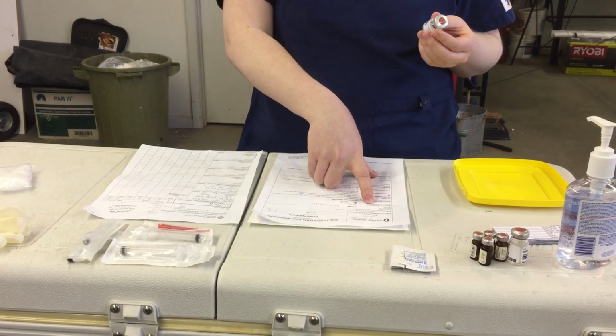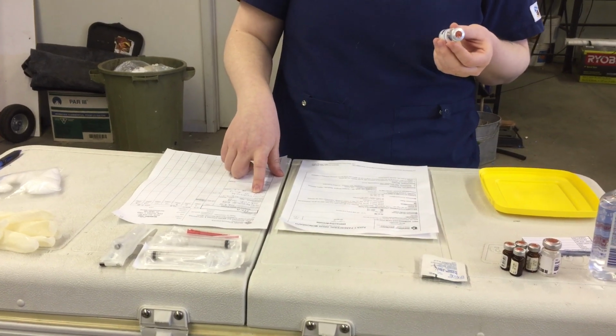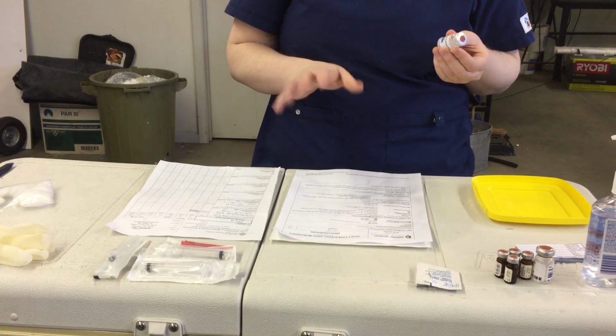and in checking that, I noticed that it says maximum single dose of 100 milligrams. And here we're supposed to be giving 150 milligrams. So I did call the physician and the pharmacy to clarify, and they did say that I can administer 150 milligrams of this medication safely. So I'm going to go ahead and do that as per doctor's orders.